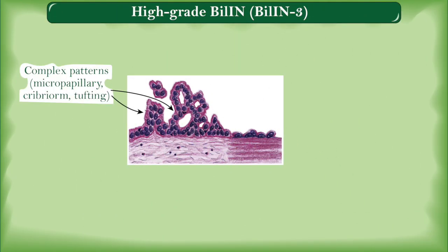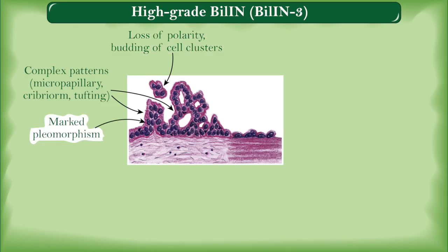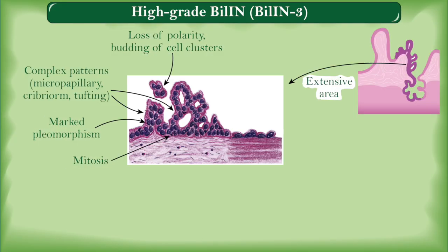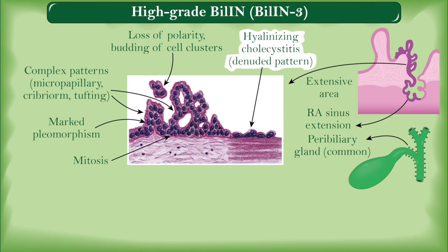High-grade BilIN is characterized by more complex patterns such as micropapillary, papillary, cribriform, or tufting. There is complete loss of nuclear polarity and budding of cell clusters into the lumen, markedly pleomorphic nuclei, atypical mitoses, and involvement of relatively extensive areas. Peribiliary gland involvement is common, and high-grade BilIN may extend to involve Rokitansky-Aschoff sinuses — one must not confuse this for invasion. High-grade BilIN arising in the setting of hyalinizing cholecystitis may demonstrate fewer atypical cells clinging to the stroma, mimicking a denuded pattern.